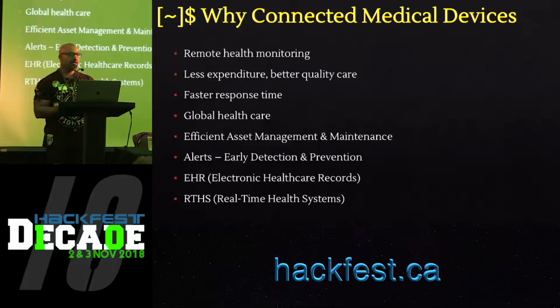So in terms of the attack surface, depending on the size of the medical device, like an insulin pump isn't that big a device, and if you look at them, they look like small trivial devices. But if you look at the attack surface, they have a lot of subsystems. There's the network part of it. Then there's the application associated with the medical device. There's the physical device hardware itself. There could be a mobile application associated with the medical device. And then there's cloud infrastructure, which is supporting the particular medical device. So if you look at the attack surface, it's actually quite large, and vulnerabilities from different platforms could be exposed through a single small medical device.